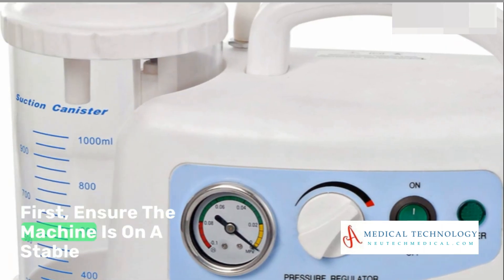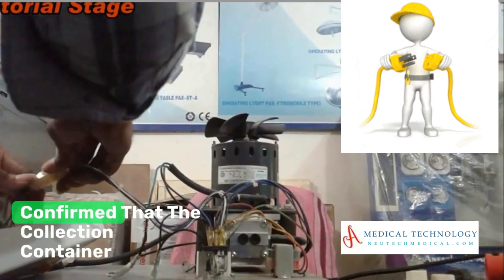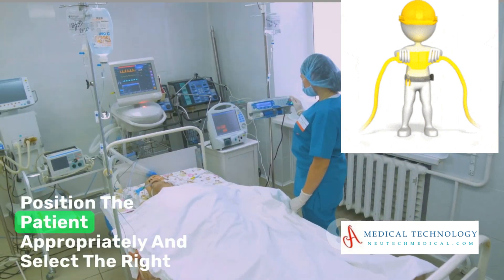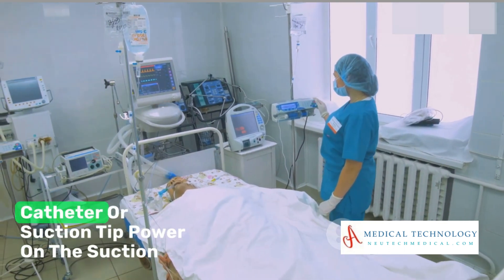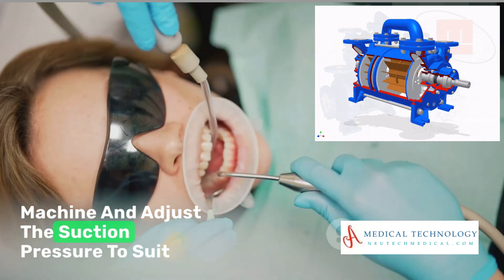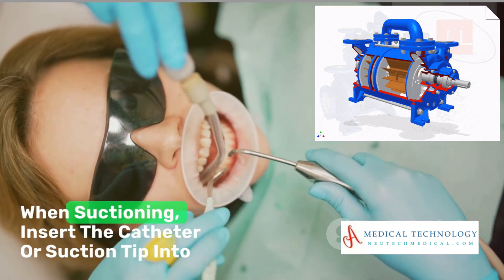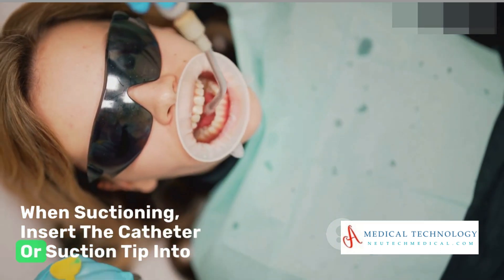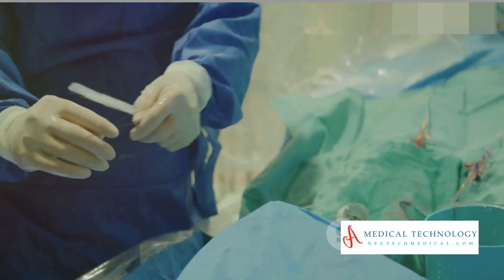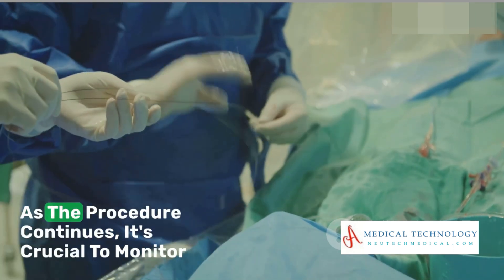The operation of a suction machine involves a series of steps. First, ensure the machine is on a stable surface and properly connected to a power source. Confirm that the collection container is clean and properly attached. Position the patient appropriately and select the right catheter or suction tip. Power on the suction machine and adjust the suction pressure to suit the patient's needs and the procedure requirements. When suctioning, insert the catheter or suction tip into the patient's airway or the required area gently.